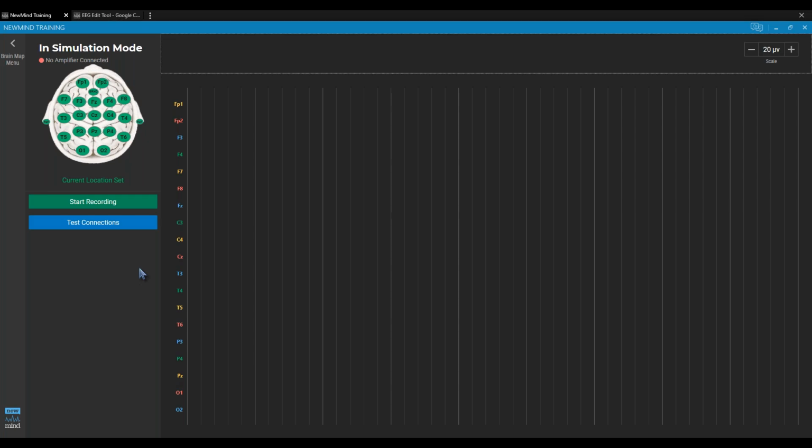It wasn't stopping and then starting again in 3 seconds. It was stopping for 5 or 10 seconds or something, and I could see some of the issues on the screen, so it wasn't some kind of technical error. I could see changes.